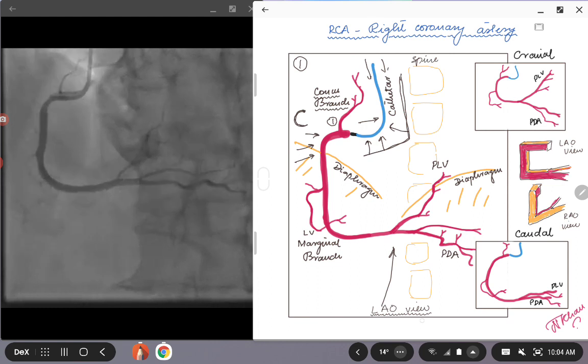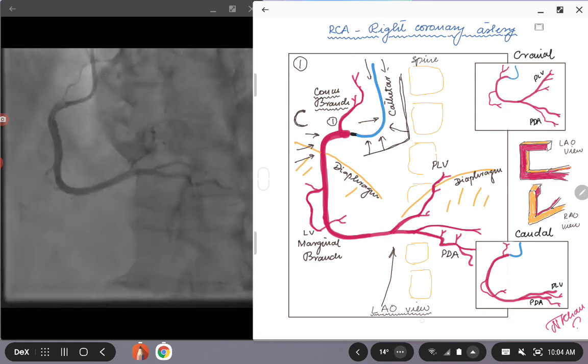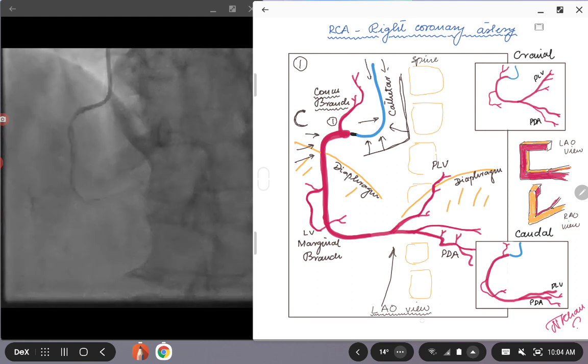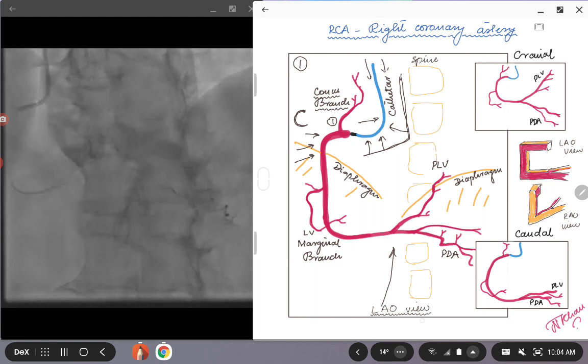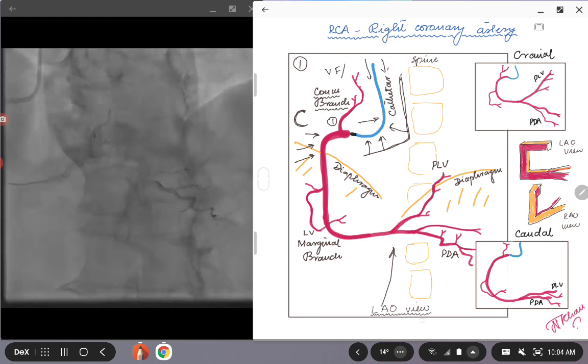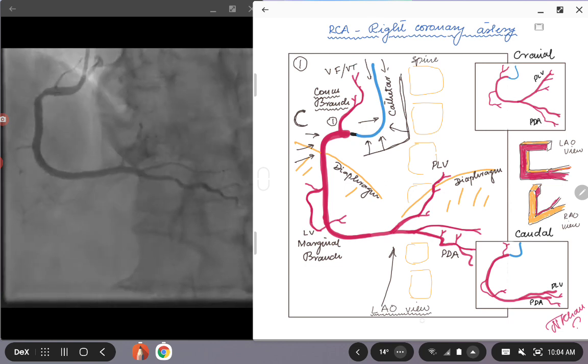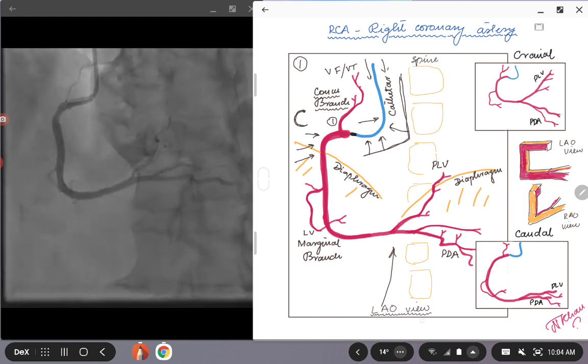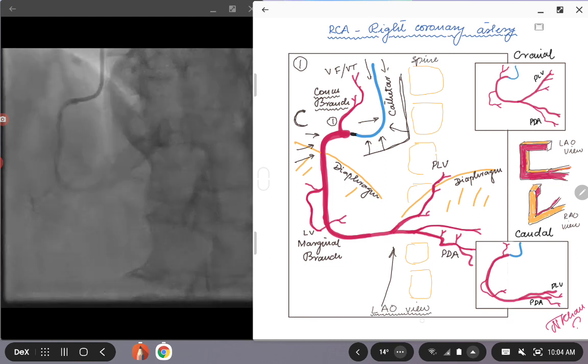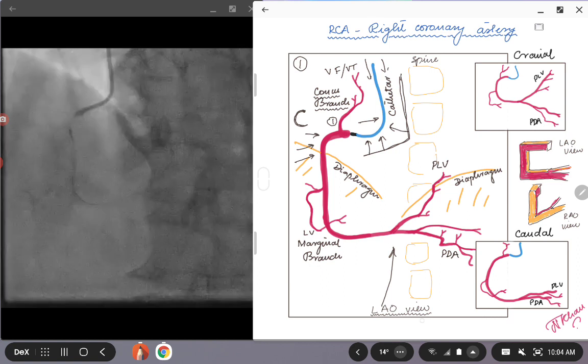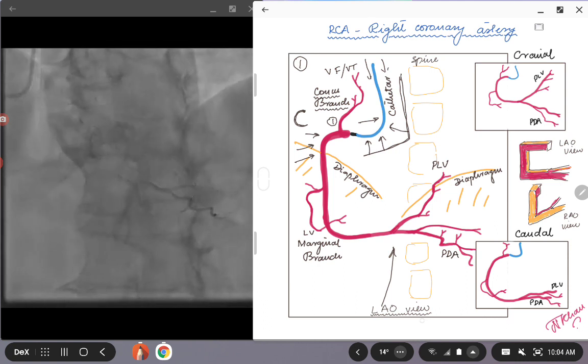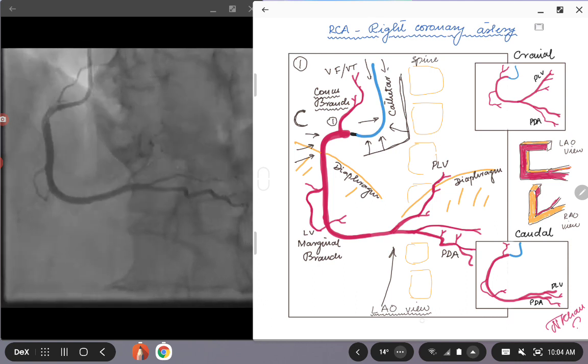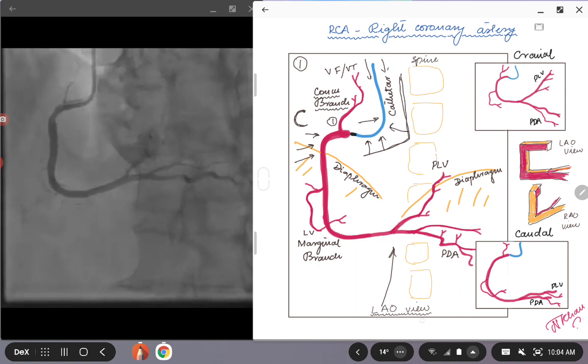In the past, it was an important branch or artery, especially if you were doing a coronary angiogram and your catheter selectively engages the conus. When you inject into that conus branch, the patient can go into V-fib or VT. The reason for that, in the past we were using dyes which were hypertonic, high osmolar with high osmolality. When you inject the dye selectively into the conus branch, the patient on the table would go into VT or V-fib.